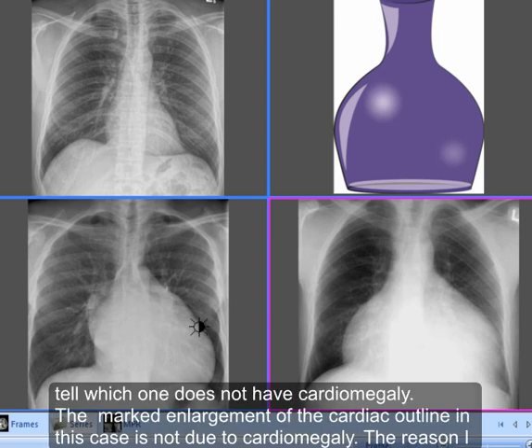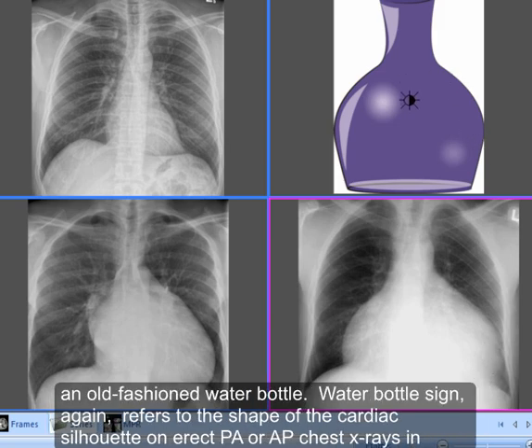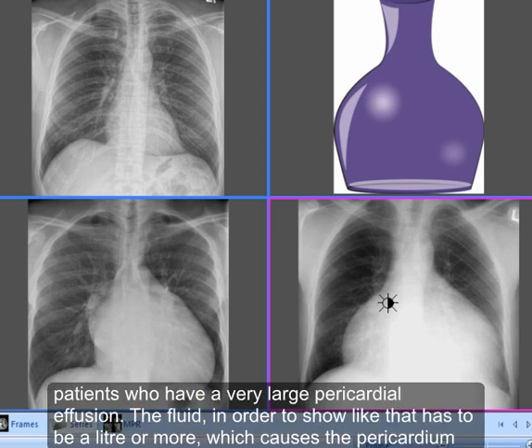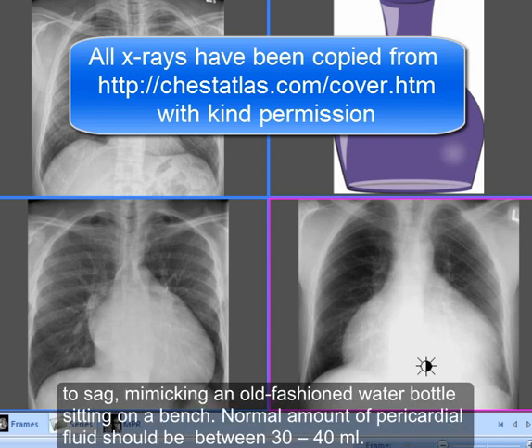The marked enlargement of the cardiac outline in this case is not due to cardiomegaly. The reason I've chosen this X-ray is that it is a wonderful example of what is known as the water bottle sign on chest X-rays — the cardiac silhouette looks like an old-fashioned water bottle. The water bottle sign refers to the shape of the cardiac silhouette on erect PA or AP chest X-rays in patients who have a very large pericardial effusion. The fluid has to be a liter or more, which causes the pericardium to sag, mimicking an old-fashioned water bottle sitting on a bench.